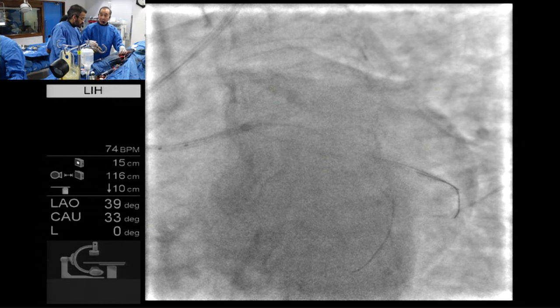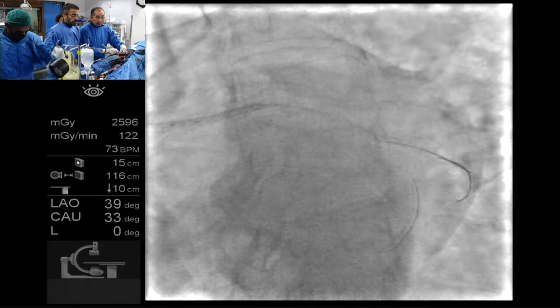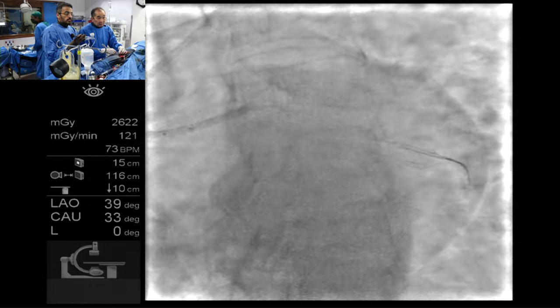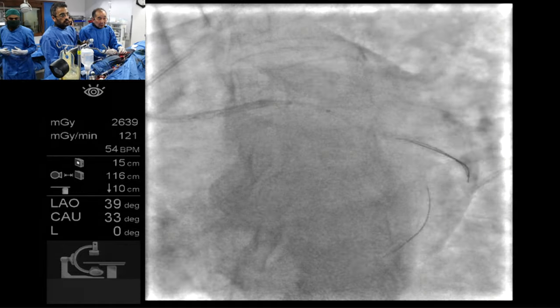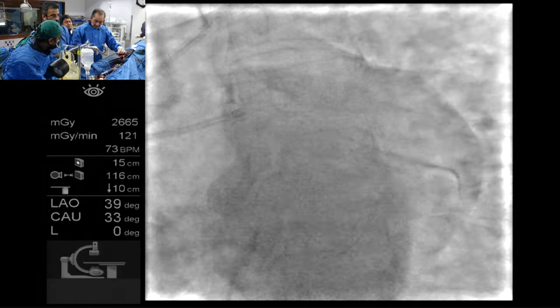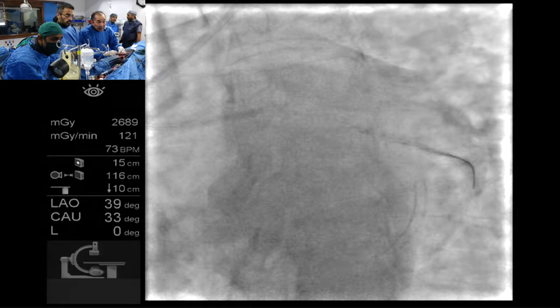So after the 2.5 balloon, we need to do a stent. The stent is at the vessel size 3.0, right? Proximal was, I think, 3.7 on IVUS, but the distal is 2.8. I think we recalled 3. Okay, good. Then we do a kissing here. Is that the 2.5 NC that you had tried earlier? Yeah, 2.5 NC and that 3.5 NC. Pretty close, right? Yeah, let's go.